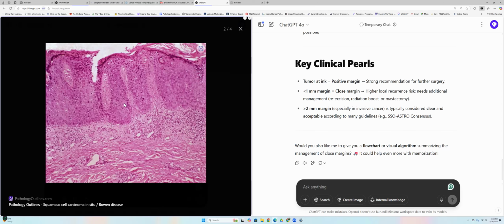I thought you said distinguish squamous CIS from Paget disease. No, that is what you use for that. Okay, no problem. So this one is invasive. You're asking about invasive. Yes, there will be focal breakouts, some nesting. Good.